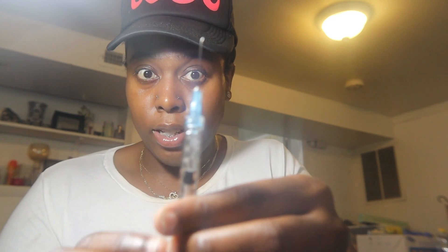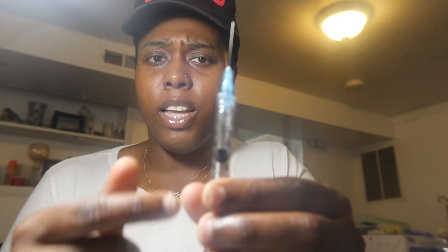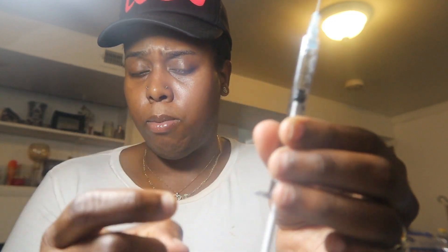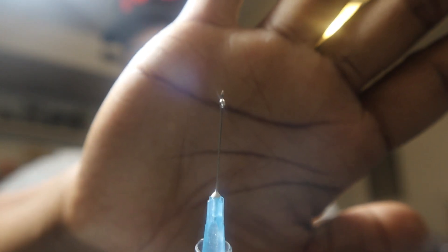I like to tap the syringe and push the plunger up slightly to make sure the bubbles are out and the medication is coming through the needle. You can see it coming out — good, it's coming out.